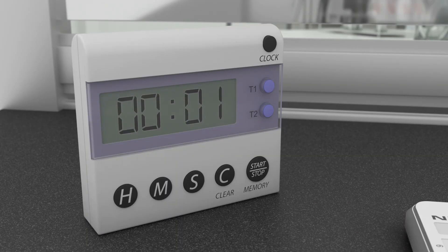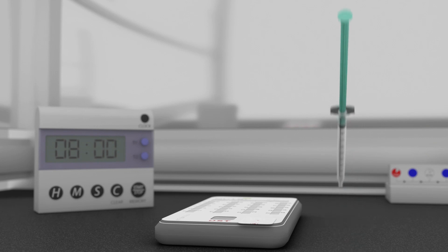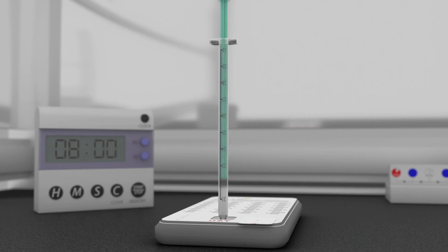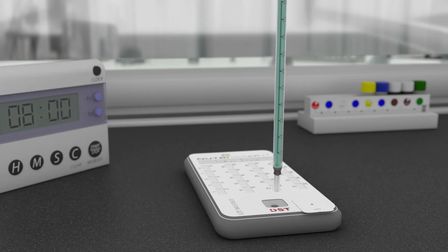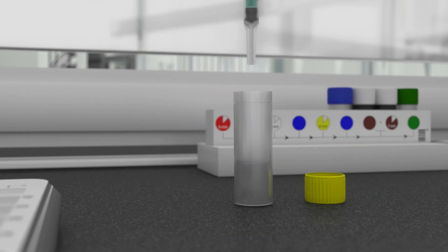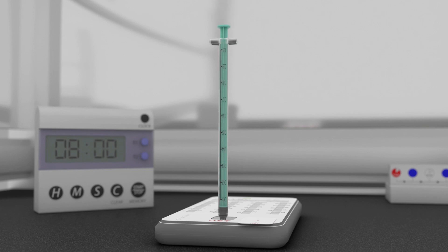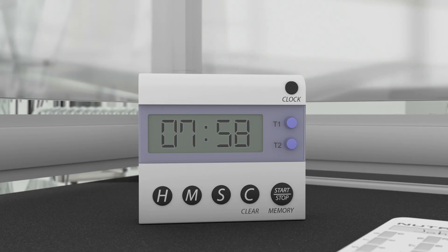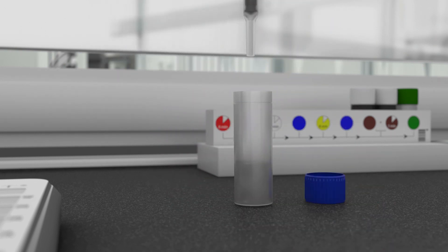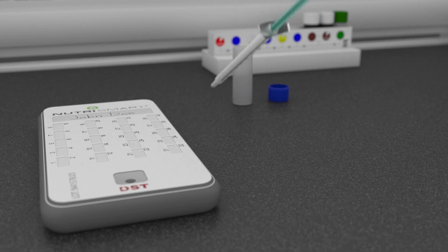Wait for the countdown timer to reach zero. Stop the timer and reset to 8 minutes. Now inject the wash solution into the cassette. Remove the syringe. Pipette the entire volume of the second antibody solution in the yellow capped bottle into the syringe. Make sure to remove all the bubbles from the syringe and inject the solution into the cassette. Start the countdown timer. While the countdown timer is running, prepare the third wash solution by pipetting the entire volume of the solution into the syringe. Make sure to remove all the bubbles from the syringe. Place the syringe next to the test cassette.